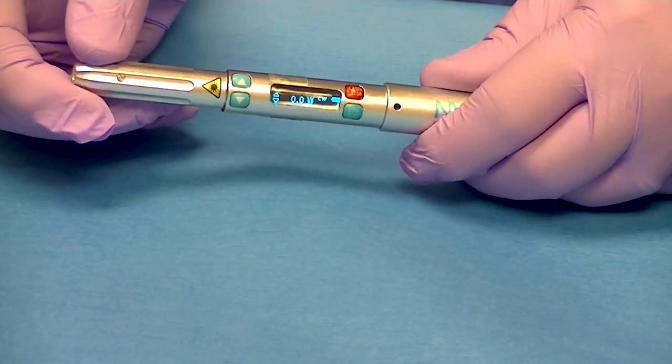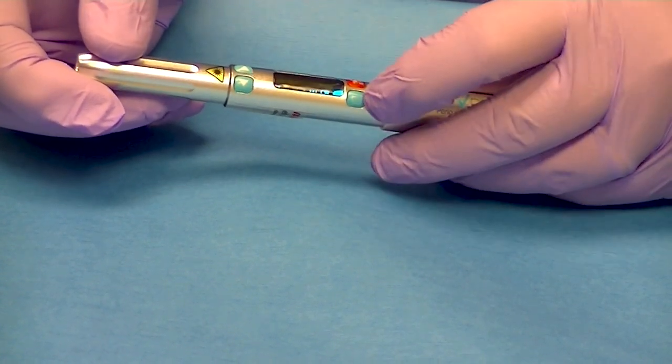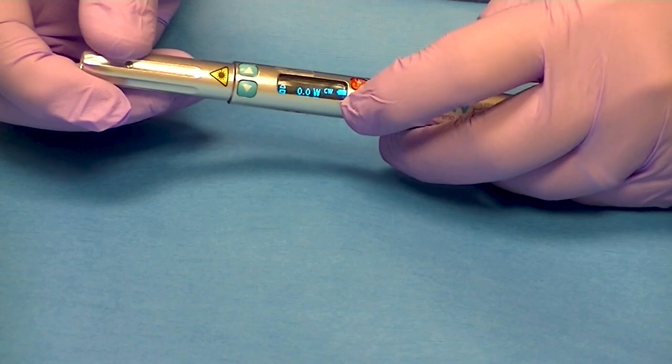The DenMat diode laser has preset settings on it. There's a menu button here where my finger's moving — little lines on it — and you're going to hit that twice.